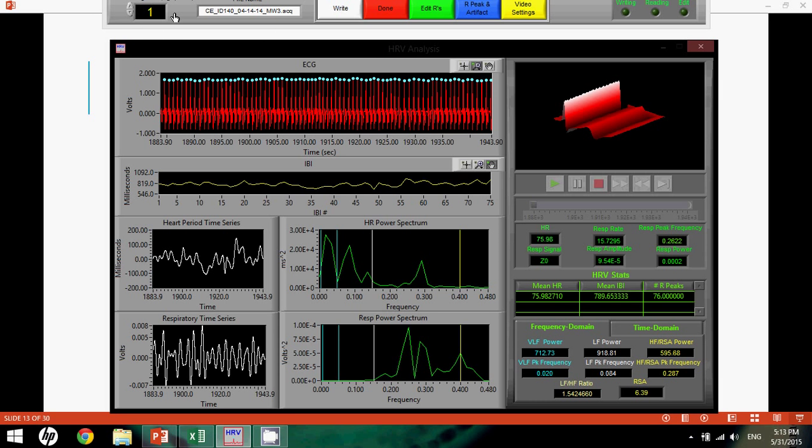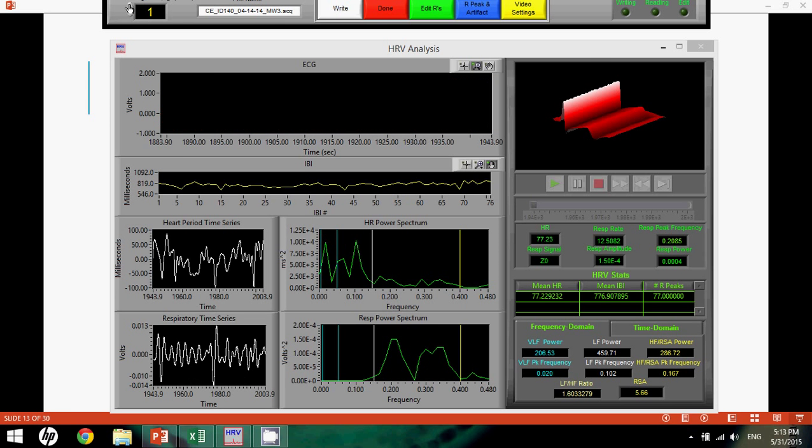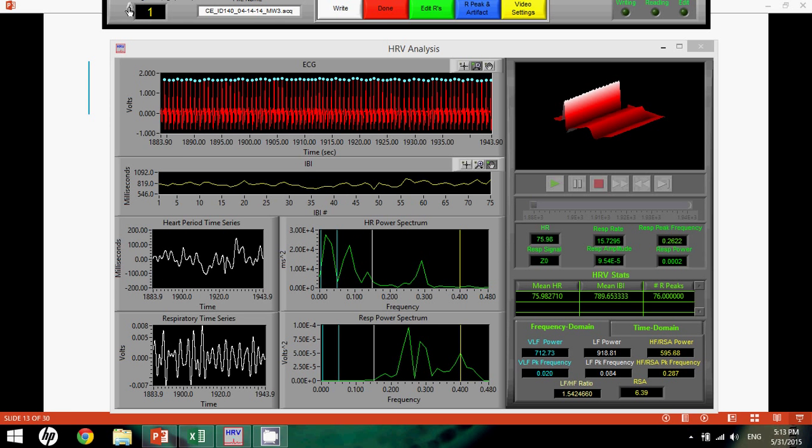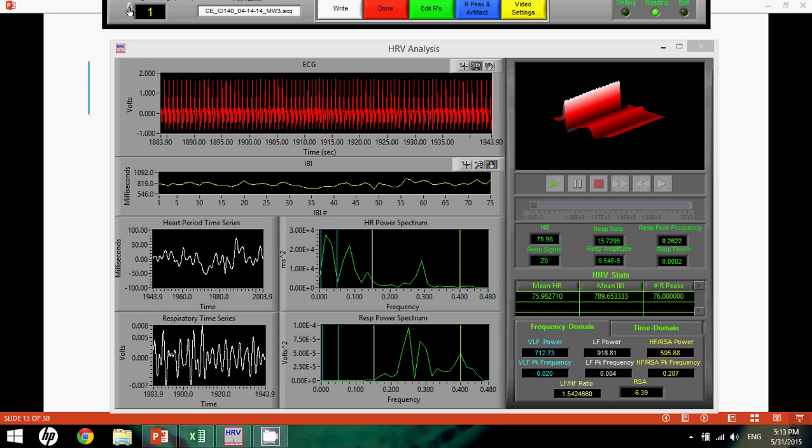You'll see we're in the first segment, but you can click on this right here, and you have options to move around through your file or through your segments. You can also make those adjustments by simply clicking on this button here, or you can also use page up and page down on your keyboard. I highly suggest getting used to these keyboard functions because it takes a lot of time to move your mouse back and forth across the screen if you're in the process of editing.